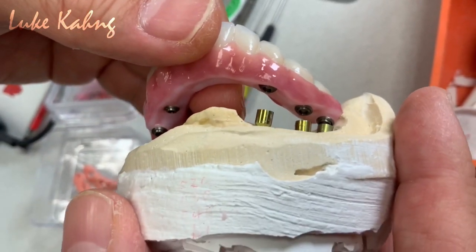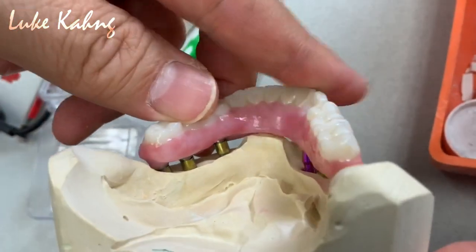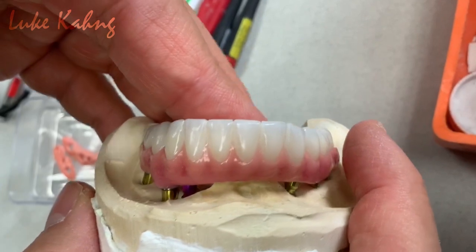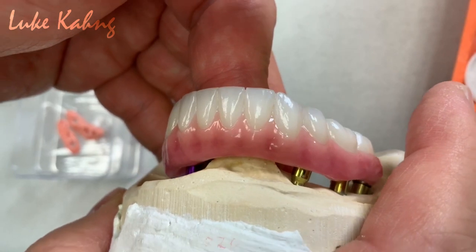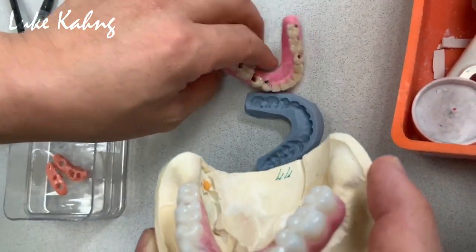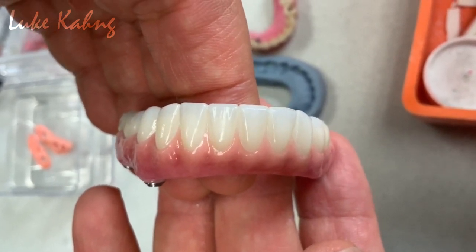6 implants. It's trying to challenge the placement of the implants, and we're trying to fit it as accurately as possible. It's good. Go with aesthetics. Follow the guidance about this, and here's the bleaching color. The finish is really good, aesthetic, awesome.